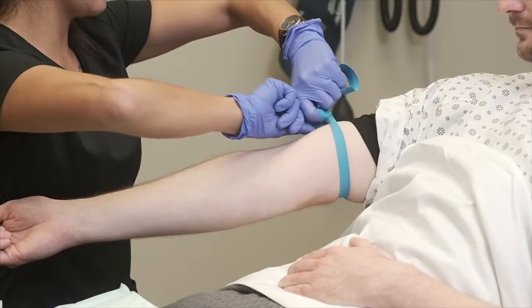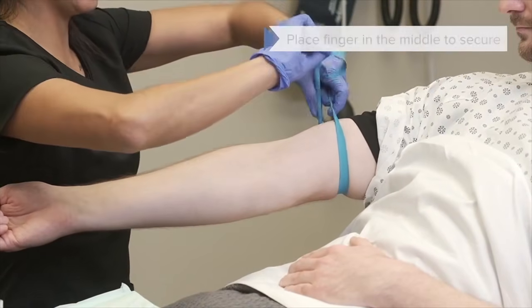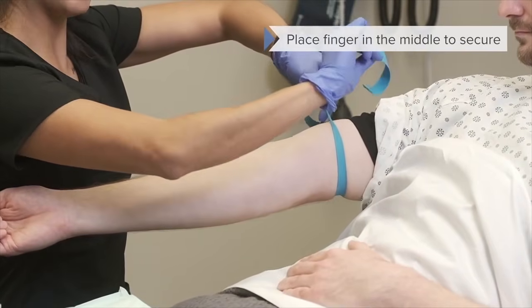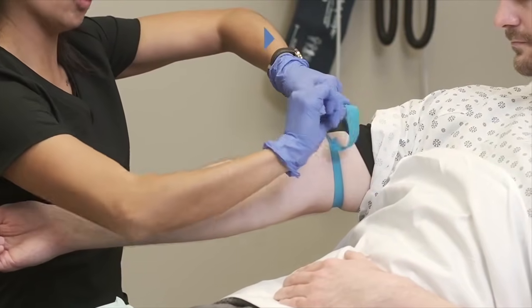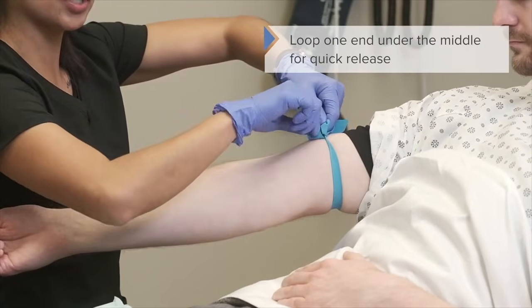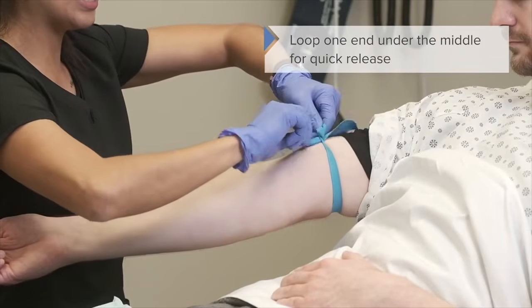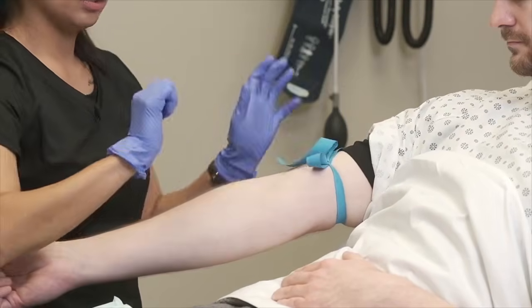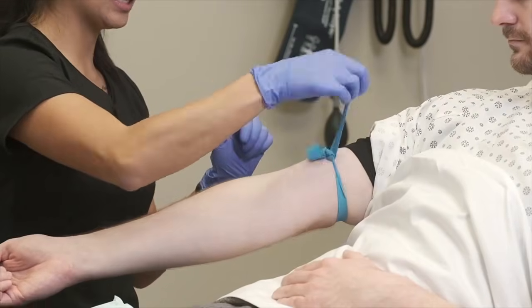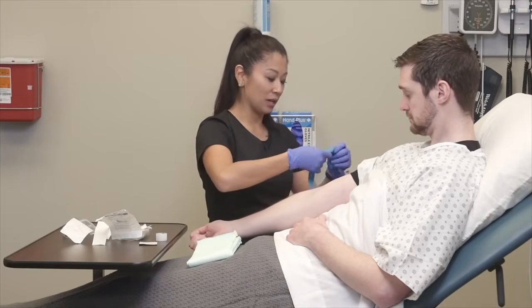So what that allows me to do is to grab this piece that's still nice and taut, put my finger here in the middle like making an X, and then I'm going to loop this ear underneath the tourniquet itself. So we're going to have a loose loop here, and you're going to see that tail out. So hopefully that makes sense to you. So if I need to release it, it's going to look like this. So I'm going to show you one more time what that looks like.